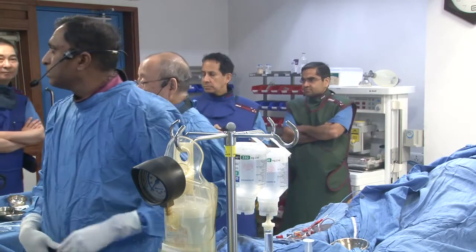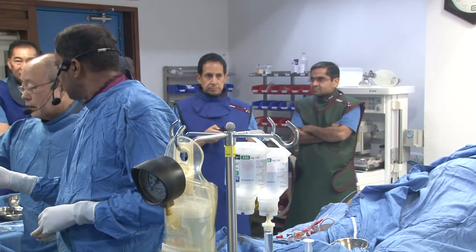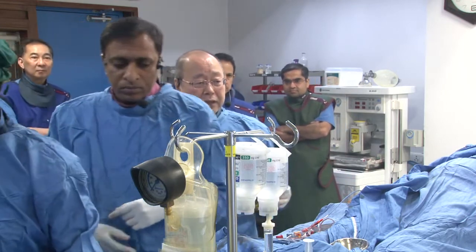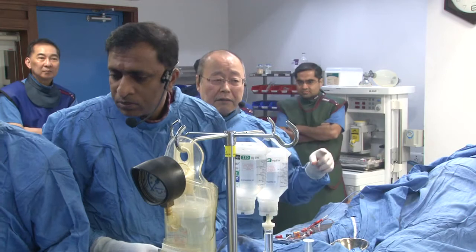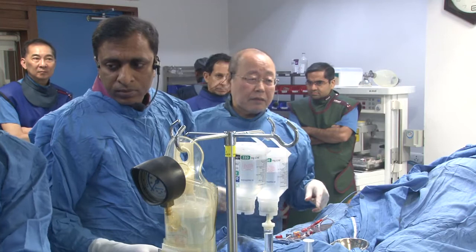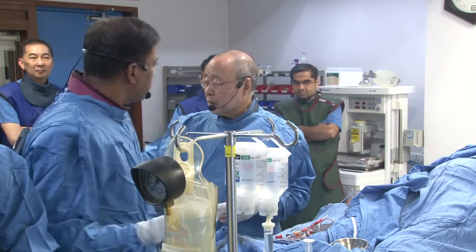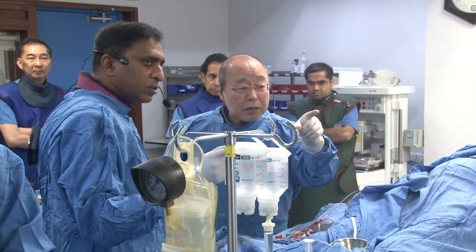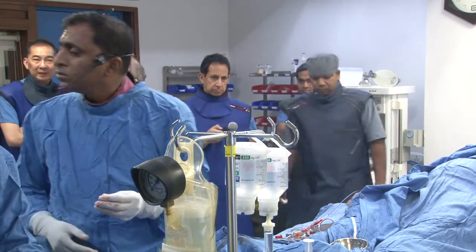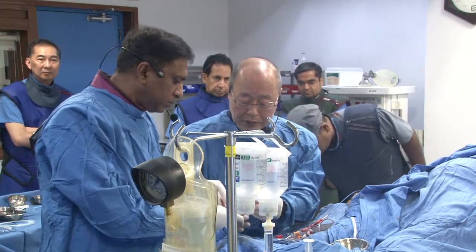Dr. Saito, do you hear us? Do you want to take a better support catheter for this case? Yes, I think in this case that is one solution. But for this particular case, I will place the anchoring balloon to the first branch. What balloon do you use? A 1.5 millimeter balloon.